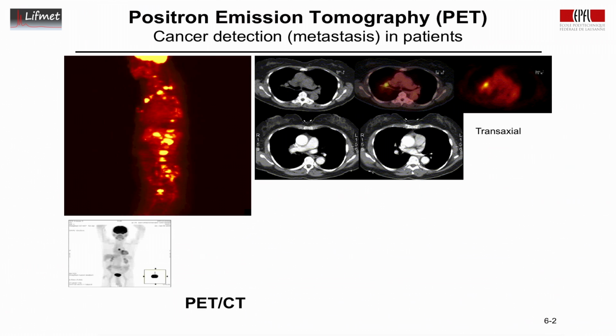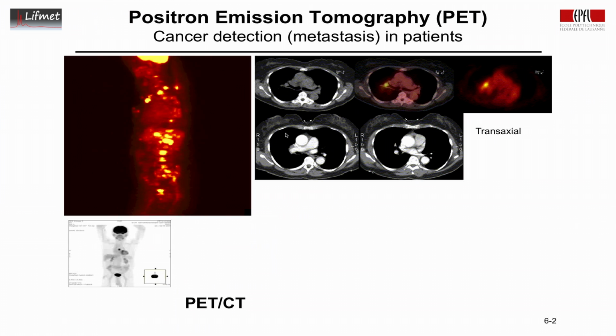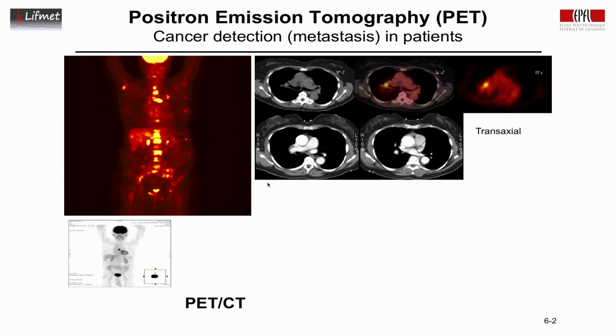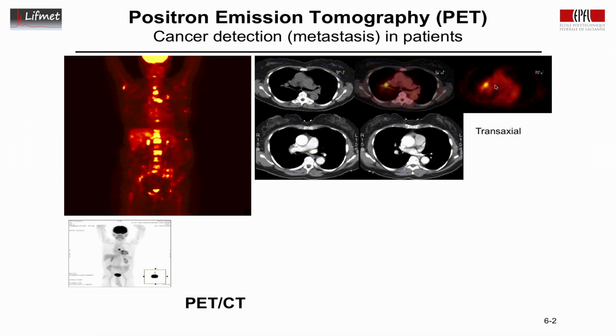These are transaxial scans. You can see here on the CT scans, you see bright the rib cage. You see the heart. Dark is the lung. There are no electrons in the lung, so we don't have any absorption here. And this is the heart here. So the CT scan provides anatomical resolution, and the PET scan brings functional metabolic information.